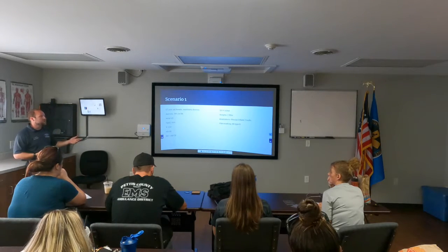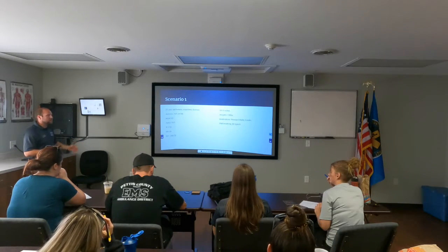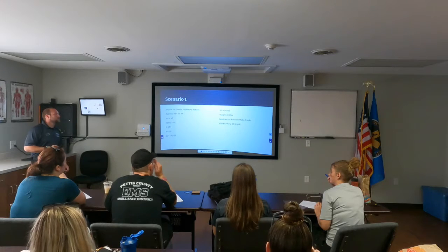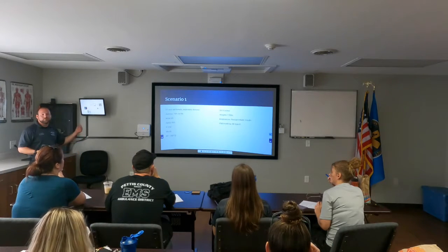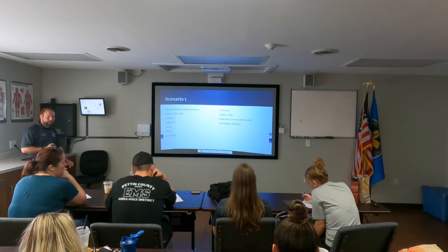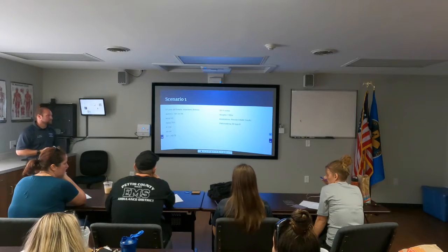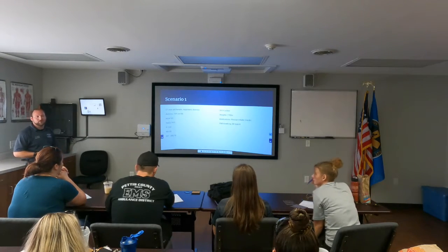She's 5'9", she weighs 170 pounds, she has a rescue inhaler, she's diabetic, and she takes insulin. So, real quick, just based upon her height, what's her ideal body weight? 66.2 kg. Yep. Okay. What's her actual weight in kilograms?